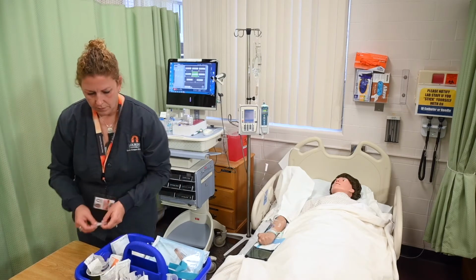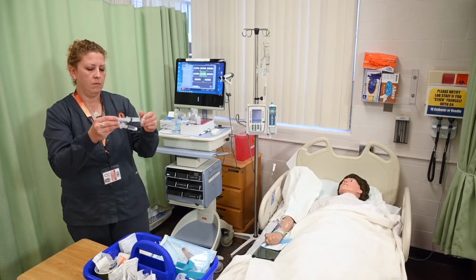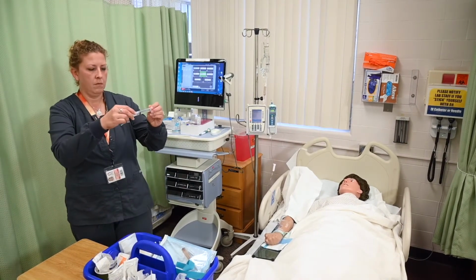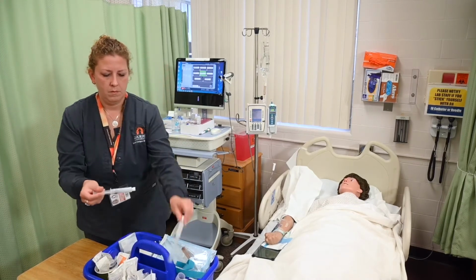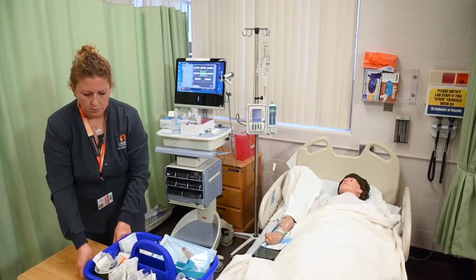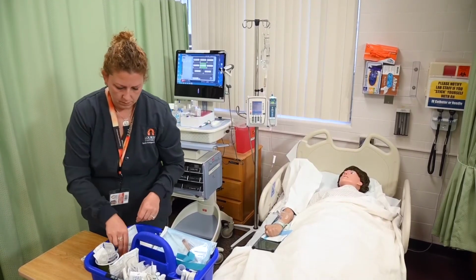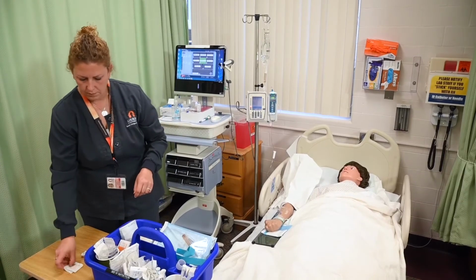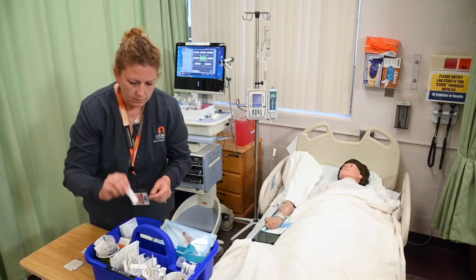0.9% sodium chloride 10 ml flush, alcohol prep pads, swab caps, appropriately sized syringes, necessary equipment for medication preparation, such as a filter straw or blunt tip needle, and secondary tubing.